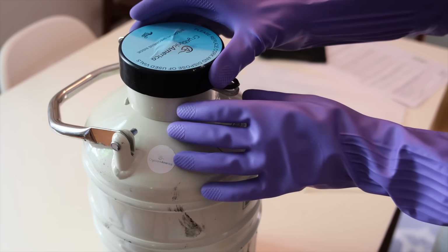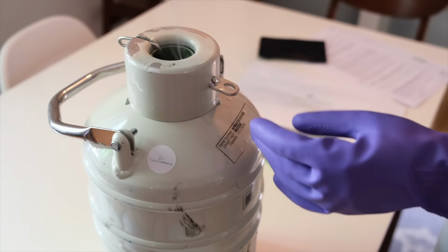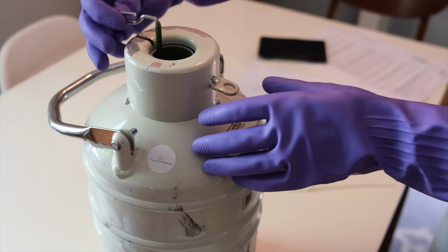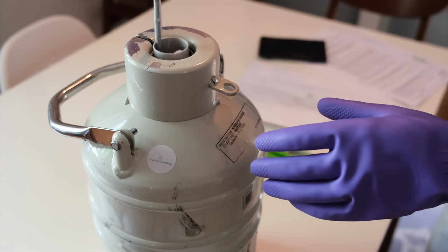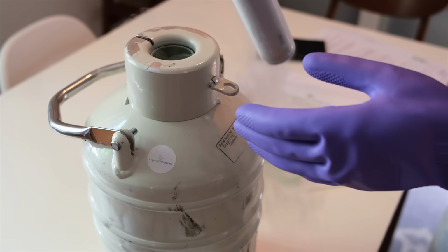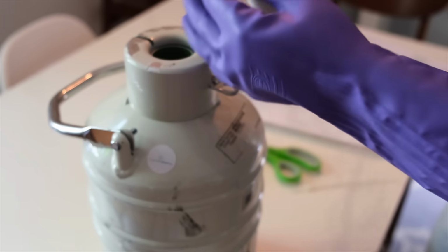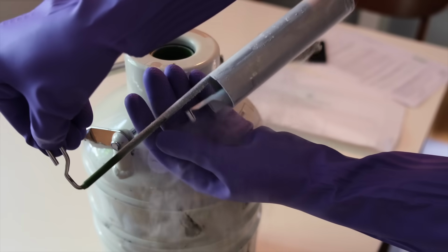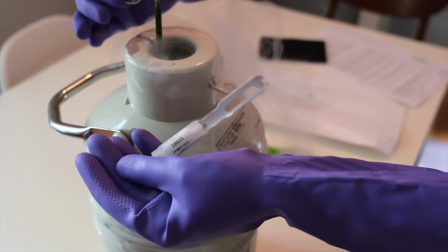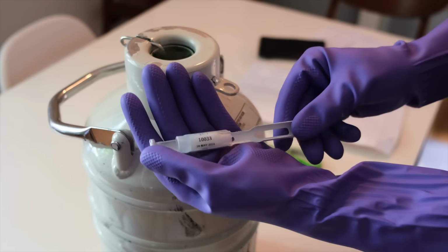And inside is the vial. We'll take off the lid, and you can just do that by slowly lifting it up. And there's a little handle here that you can use to grip it. So it will be smoking cold. Look at that. Isn't that awesome? You'll see inside there's some information on the top about your donor ID. And I will pull this out so you can take a look. We can just put this little holder back in, and it will be cold. You can feel it through the gloves.